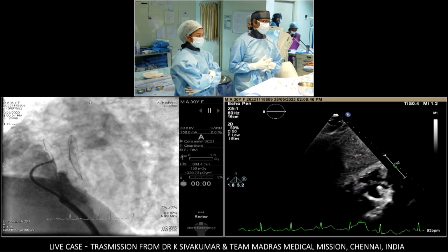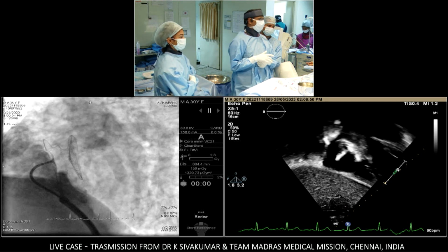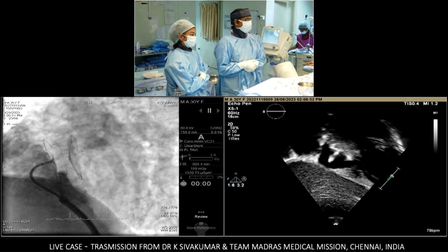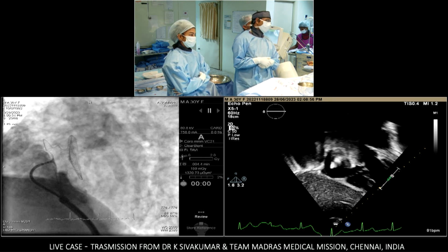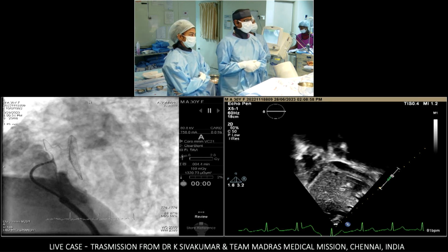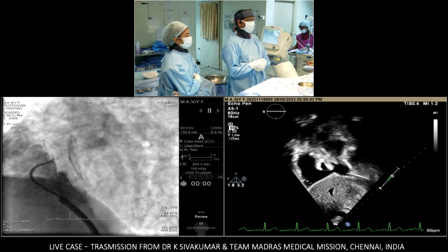Okay, Shiva, we've got 2 minutes or so. Yeah, I think the apical 4-chamber view that Srija was showing me was looking quite good. Srija, can you get me one subxiphoid short axis also? Yeah, just magnify that.